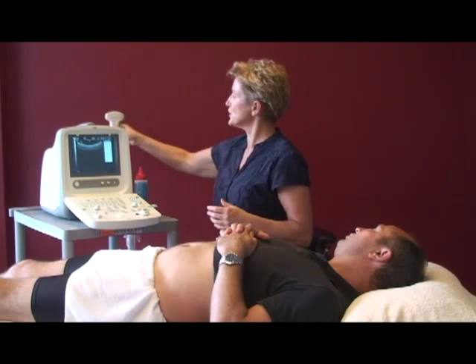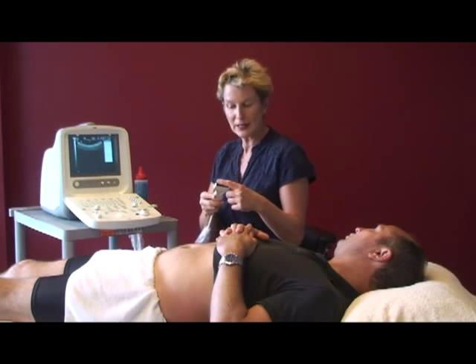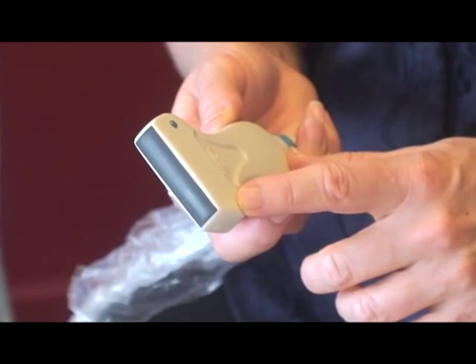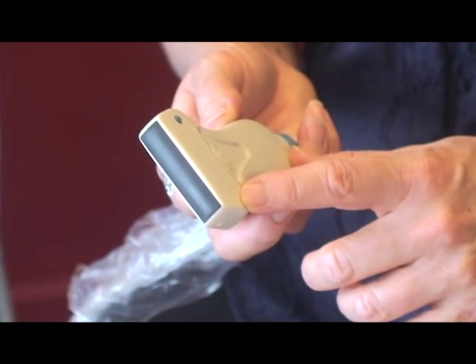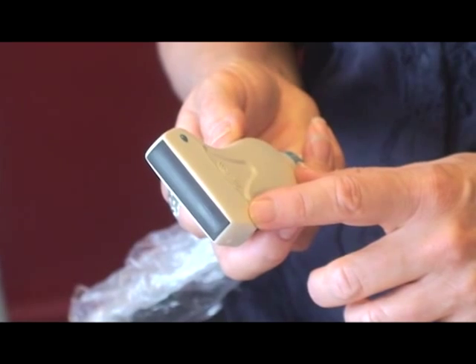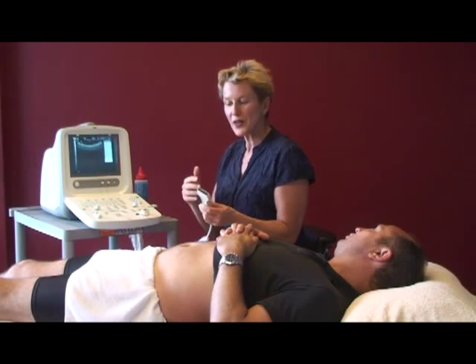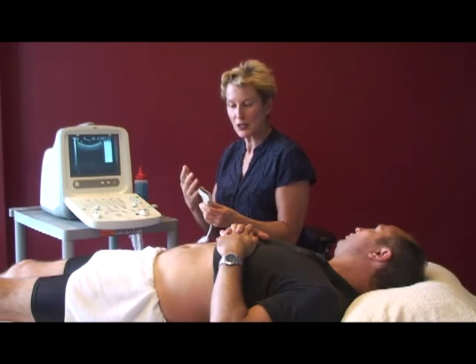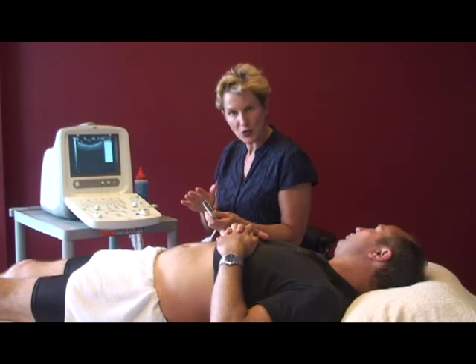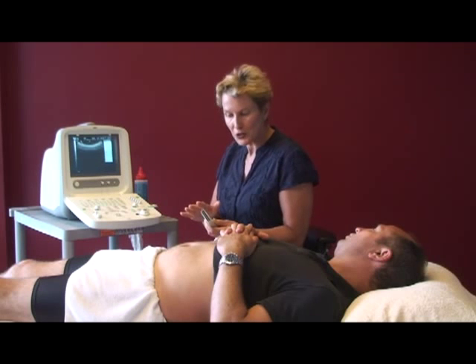Now you have another transducer. The second transducer we call a linear head. With the linear head you have a higher frequency, anything from 5 up to 10 megahertz. And that's the important thing to remember. With a higher frequency, you'll be looking at more superficial structures. With a lower frequency, you can look a lot deeper.